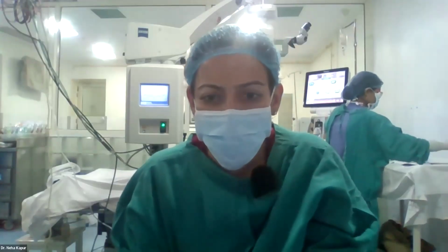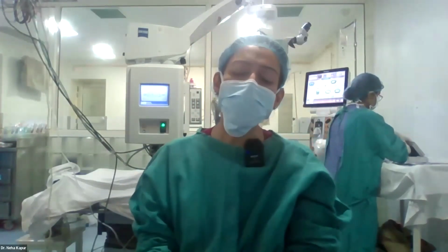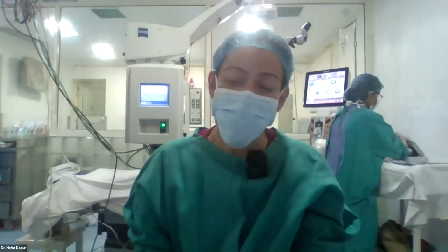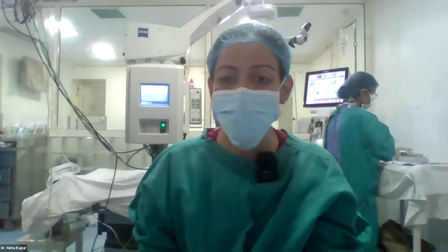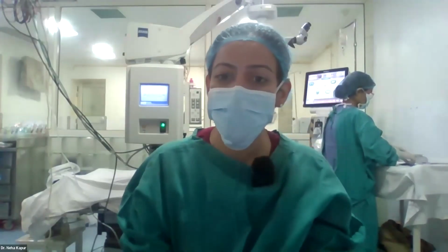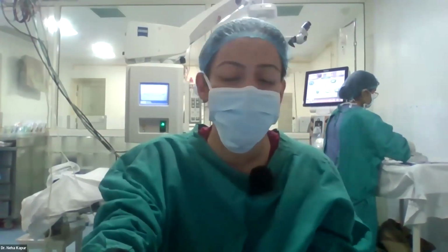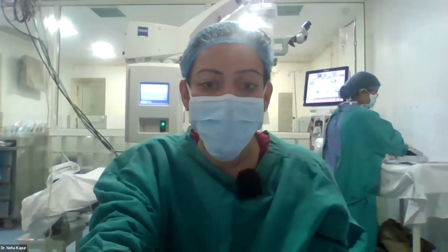Is it correct to pass the suture through the graft to stabilize it? Usually if you're dealing with an aphakic eye, to make sure that the graft doesn't go anywhere, yes, sure, you could do that. But otherwise, if you're dealing with a pseudophakic and you don't expect any of this trouble, it usually is not first preference to do it.